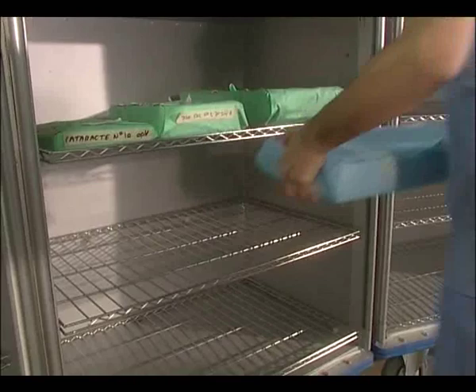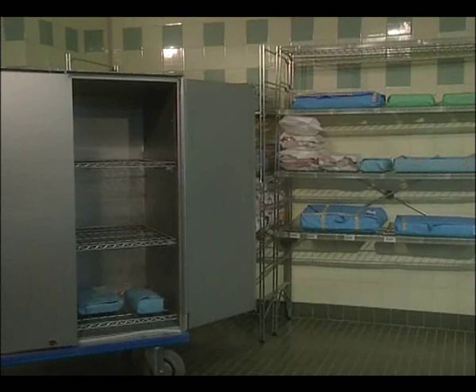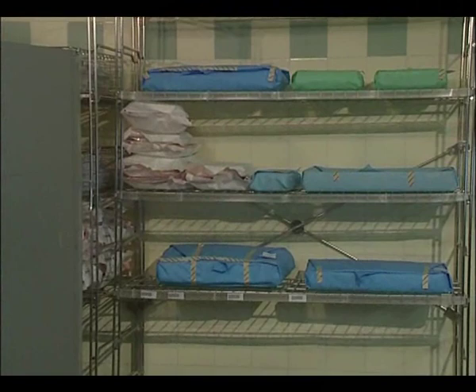The sterilized packs must be handled with care as they are removed from the sterilizer and are placed in bins, transport cabinets, or trolleys. Friction of the packs against the shelves should be avoided to reduce any risk of damage to the packaging.